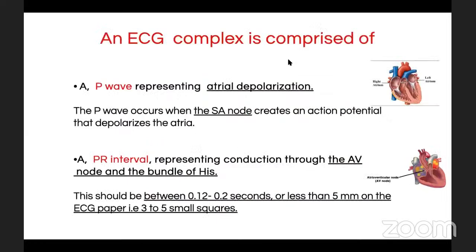أوكي طيب هذا نفس الكلام اللي قلته قبل شوي إن ال ECG complex comprised of P wave. وقلنا ال P wave represents مين يعرف؟ مين شارك؟ إذا شفنا ال P wave نعرف من خلالها ال atrial depolarization. أوكي شكرا. أوكي نعرف إنه صار في atrial depolarization.